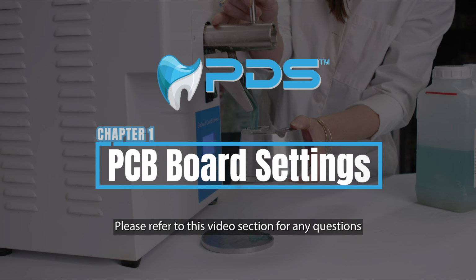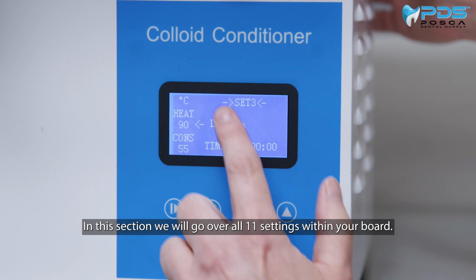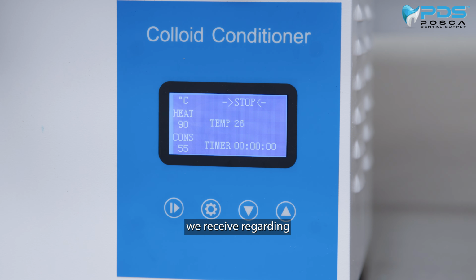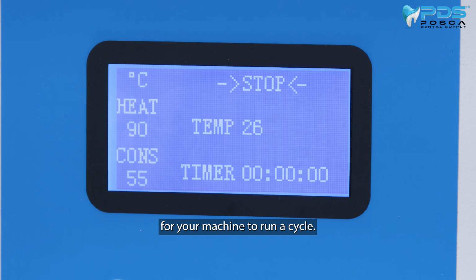Please refer to this video section for any questions regarding the programming of your PCB board. In this section, we will go over all 11 settings within your board. The most common question we receive regarding our PCB boards is regarding the timer function. The timer function must be set to all zeros for your machine to run a cycle.